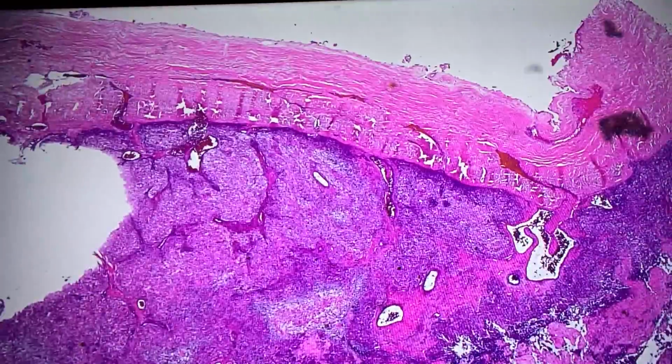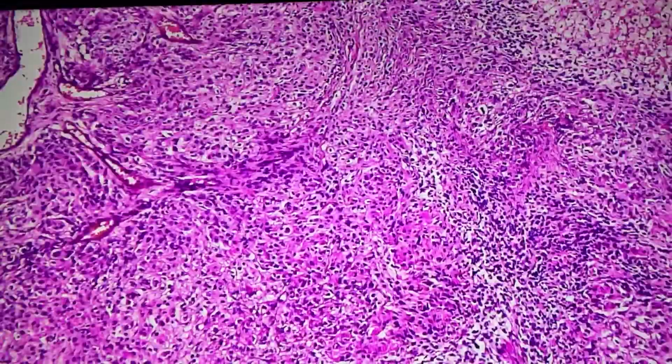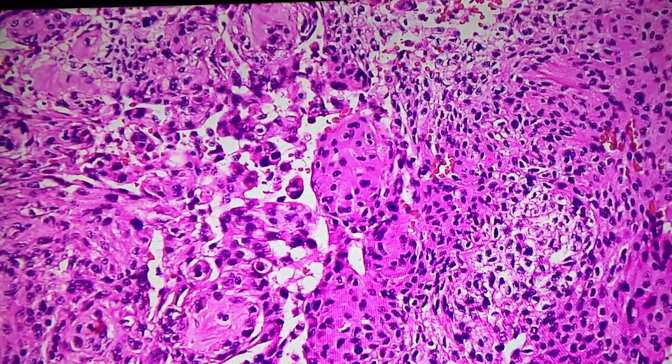What is this? Even I don't know. Okay, so it's dura based, right? And we've got something in here. Anyone?